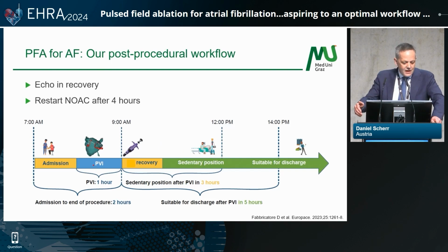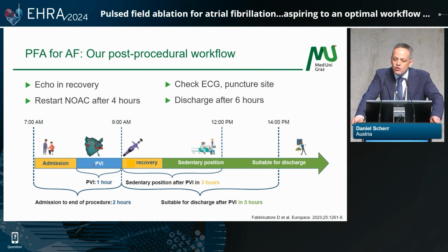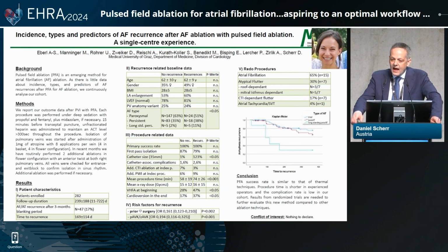So at the end of the day, our post-procedural workflow consists of an echo in the recovery, the restart of a NOAC 4 hours after the procedure. We check the ECG, the punctured site, and discharge the patients 6 hours after the procedure.